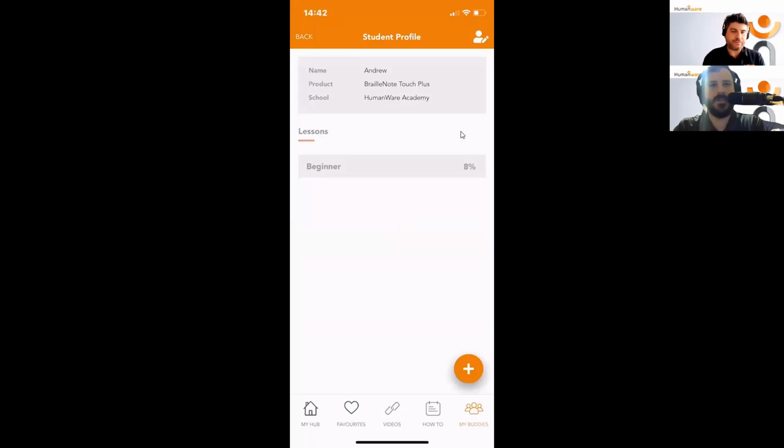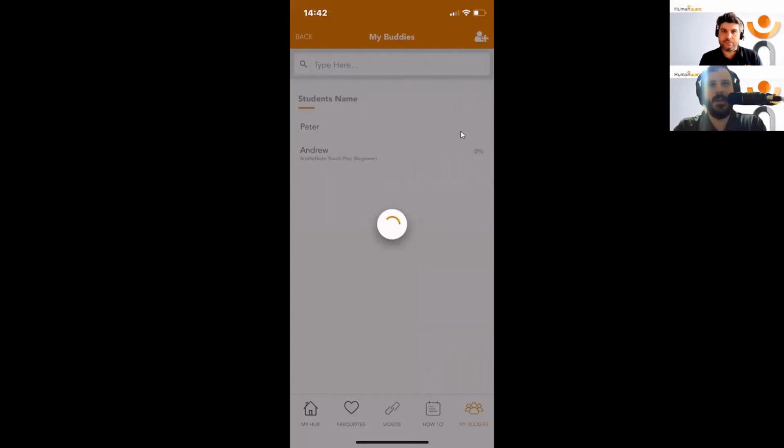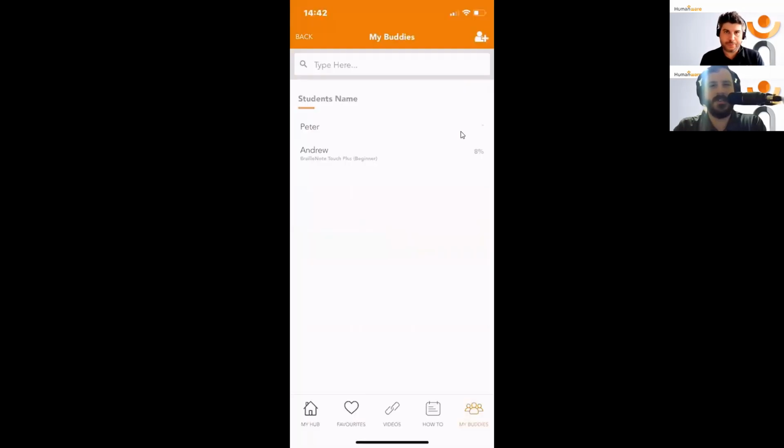The other piece that I'll mention here, Andrew, and for anybody out there, because we're not using VoiceOver, is that this app is fully accessible. There is just an awful Zoom bug where VoiceOver and speech just goes away, so I would be fumbling all over the place. This is accessible with VoiceOver and usable, and it works great. But right now, when we do these webinars, it's very difficult to illustrate how it's accessible, because of casting and sharing the screen the way VoiceOver comes through to the screen share. So keep that in mind for anybody out there who is a VoiceOver user, that this certainly works with VoiceOver. Yeah, thanks for mentioning that, Peter.